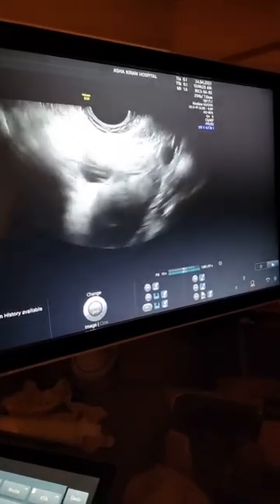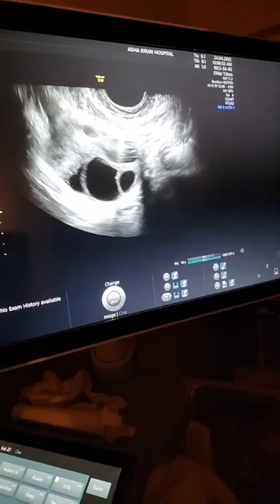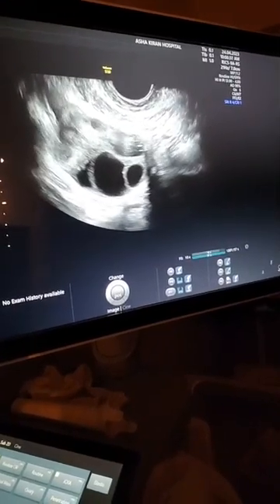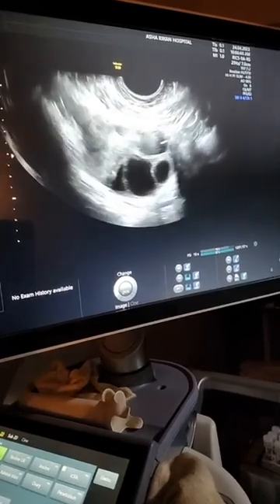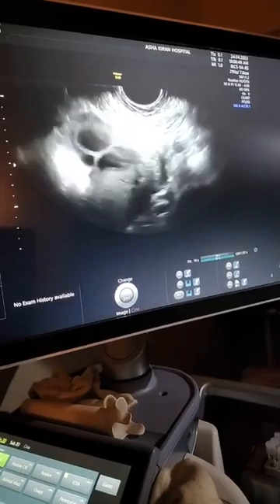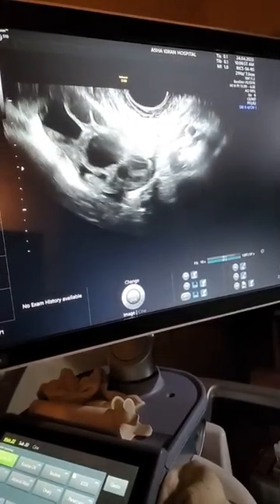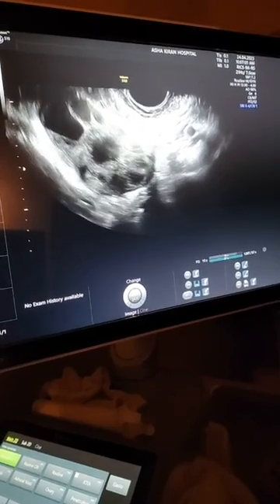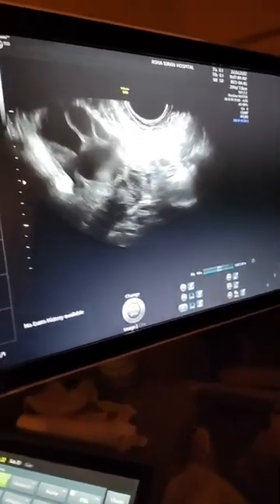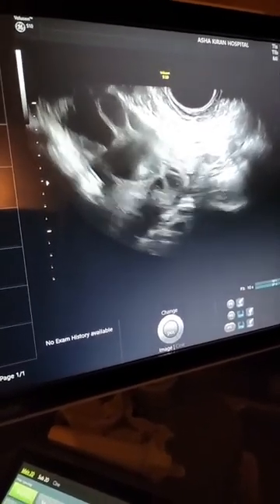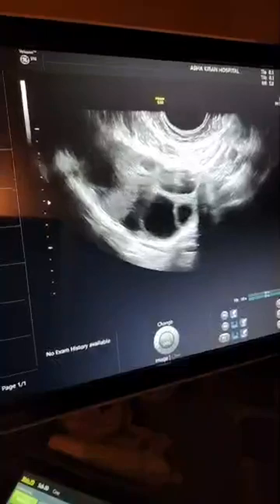Now again I will see these two or three follicles that remain and go again. This is the better position for me and here I go. I know we are not going to have a good outcome like usual because this is the only one ovary which has been there. We have to do the full side pickup. You can see my needle coming in.